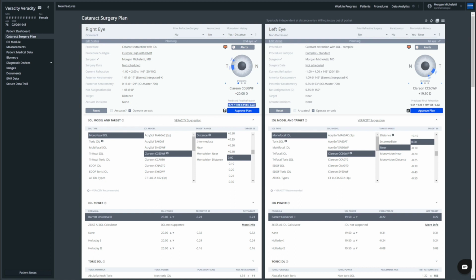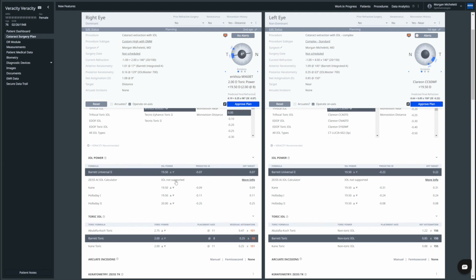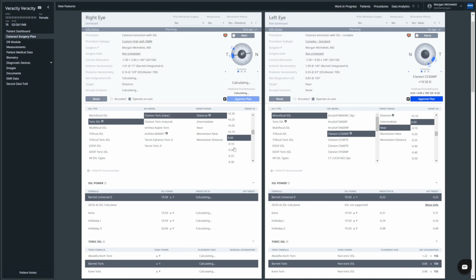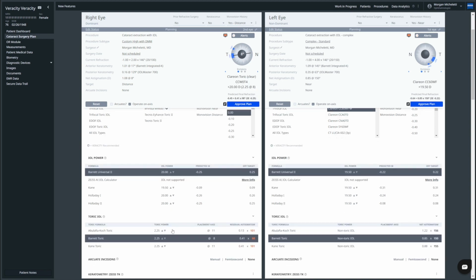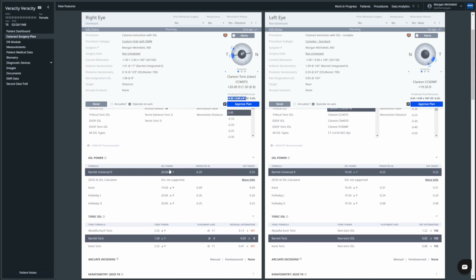I'll say, look, this is your predicted glasses prescription if you go forward with the standard insurance covered option. But let me show you what happens if we go ahead and do one of the upgrades, if we treat your astigmatism. All of a sudden you can see that number gets a lot smaller. And we'll adjust it here just to be as close to plano as we can. Maybe a little different lens that has a little more astigmatism treatment at the corneal plane, at a T3. That's a T4. Go down to a T3. And there we go.